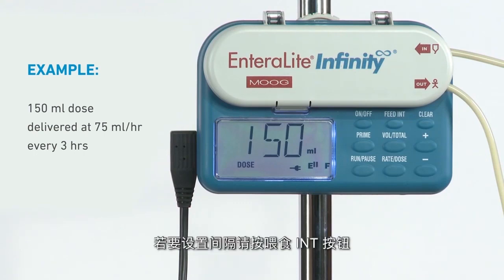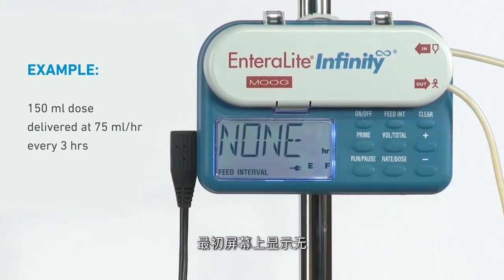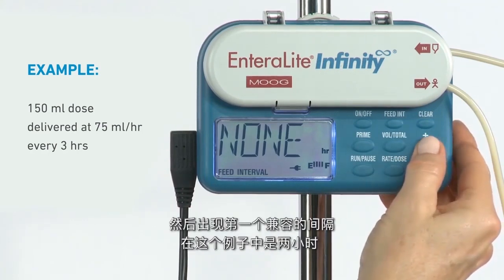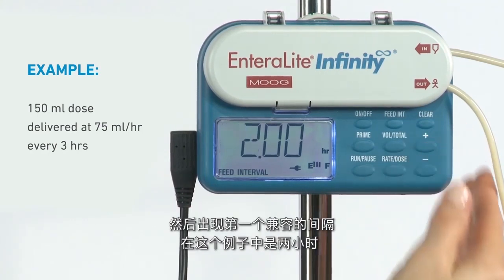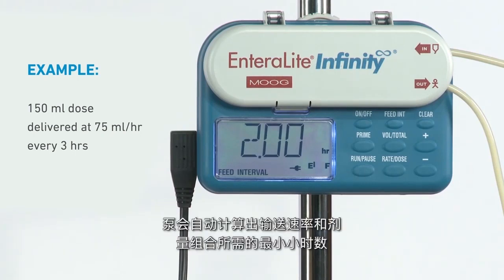To set the interval, press the feed INT button. Initially, the screen displays none. To set an interval, press the plus key and the first compatible interval appears, which in this case is 2 hours. The pump automatically calculates the minimum number of hours it will take to deliver the rate and dose combination.